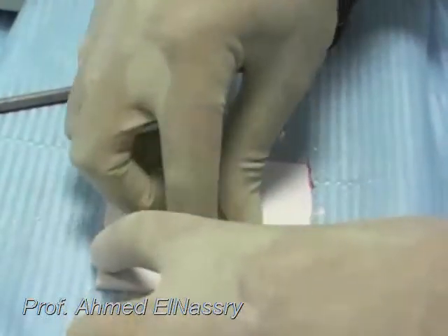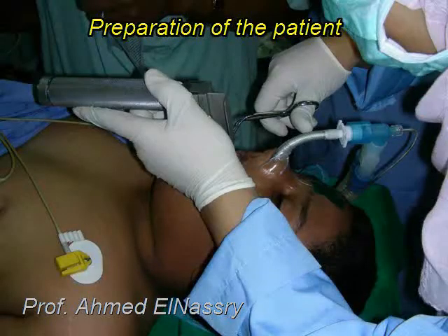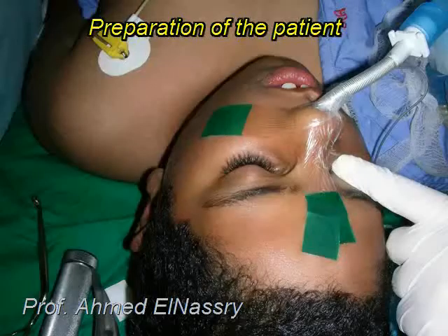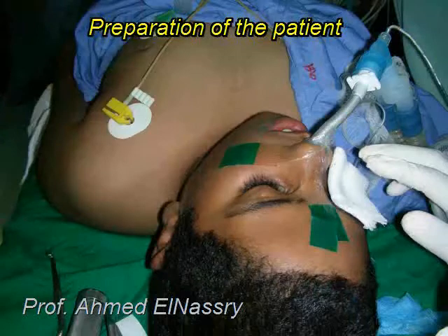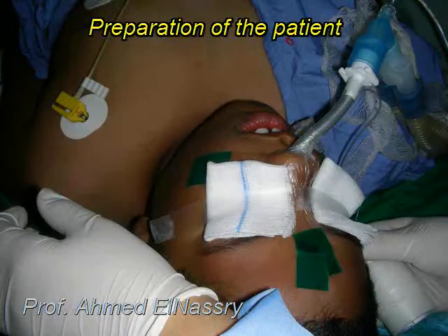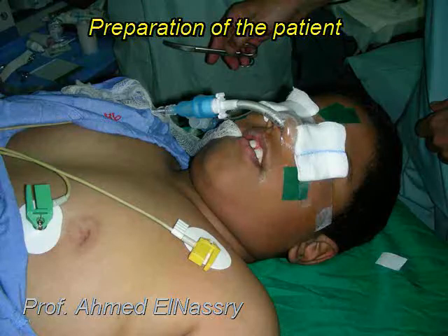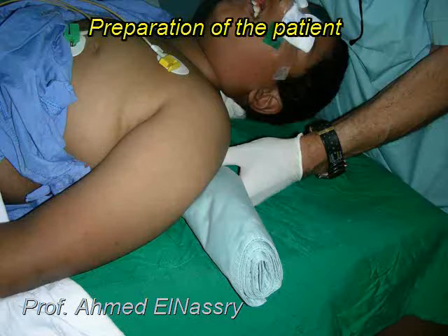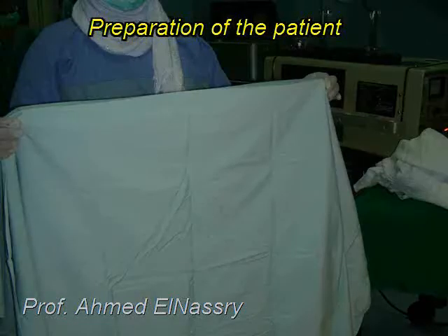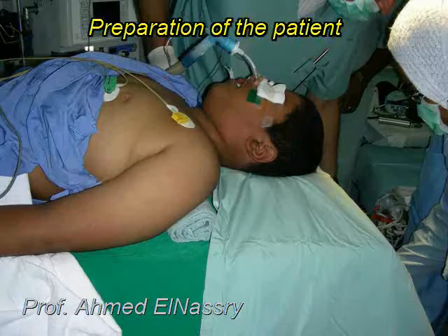The medication mix is now ready. After that, we shift to preparing the patient, starting by inserting and setting the throat pack and securing the endotracheal tube. Covering the eyes with gauze and securing it with plaster — two layers, upper and lower, to completely secure the eyes. Inserting the under-shoulder support and head ring, then beginning to cover the patient, covering the head completely except for the mouth.